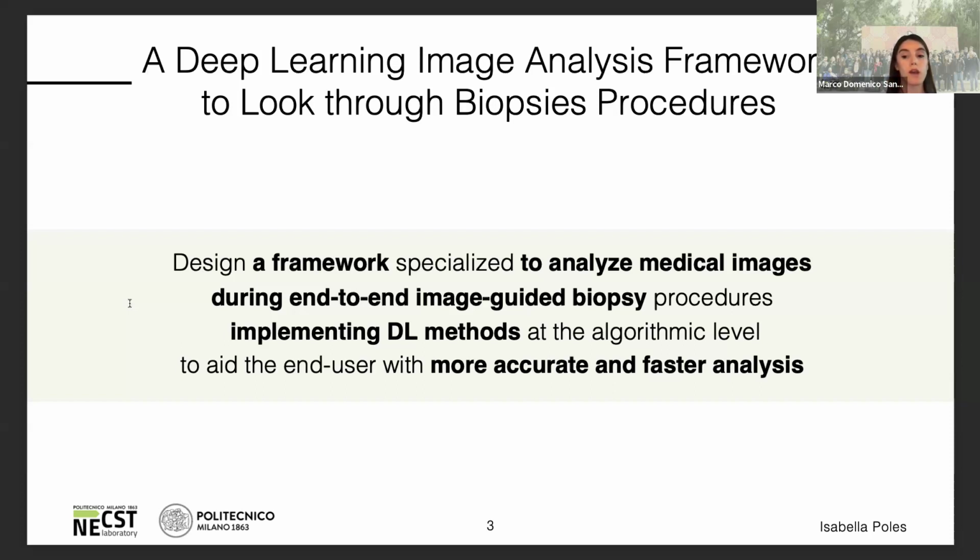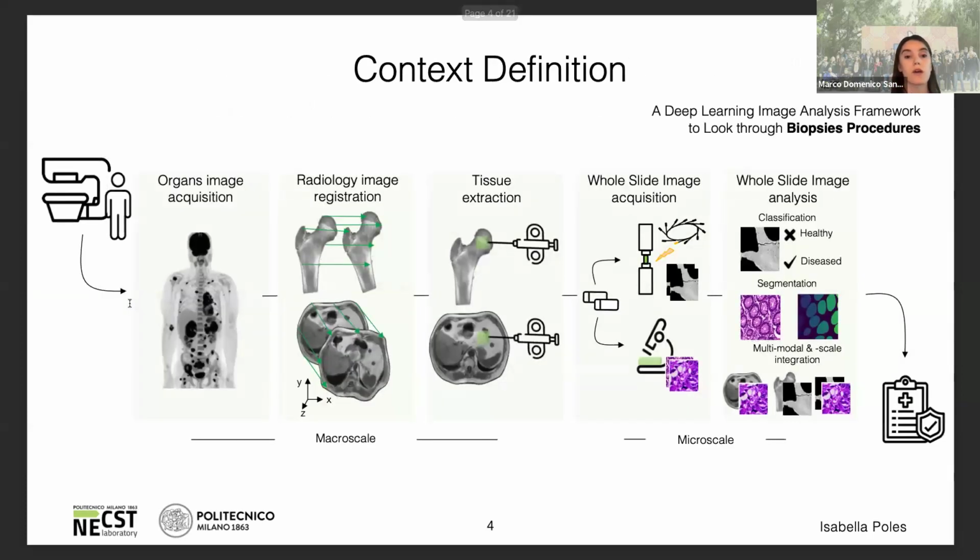accurate and faster analysis. So given the complex application scenario, I will start introducing you to the world of biopsy procedures. They are multi-step, multimodal, and multiscale medical procedures that start from the acquisition of images of a diseased or healthy organ from a patient of interest. And then it proceeds by aligning them to a common reference frame through the image registration step.